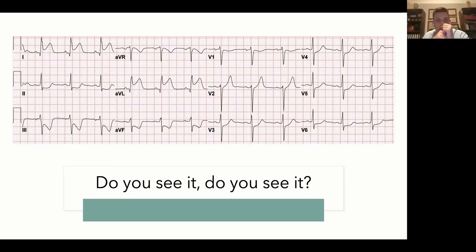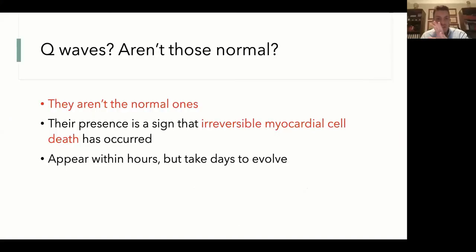So you're correct. So the presence of all of those is necessary, and we will talk about why, because this is how we will differentiate STEMI from pericarditis. Okay. So you need ST elevation and contralateral ST depression present in order to diagnose a STEMI.